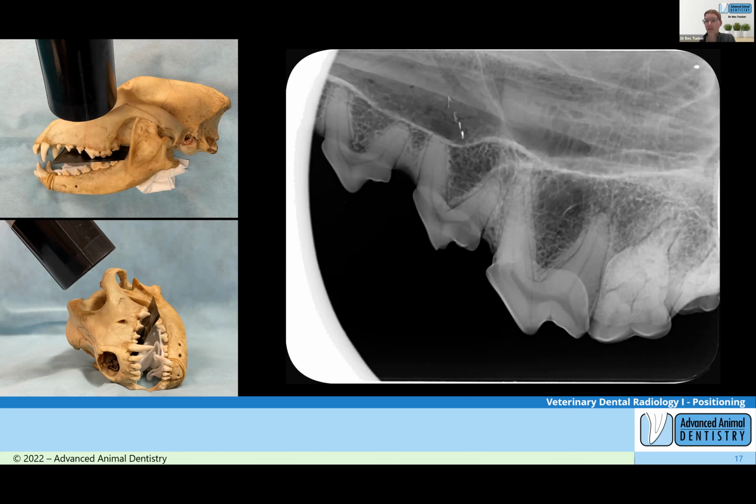If I have an owner or I'm not sure what I'm going to be doing exactly in advance and I need to speak to an owner about something, I'll radiograph one side, roll the patient, radiograph the other side, contact the owner, work on that side, and then roll back, and it's still only moving the patient twice. Yeah, but I agree, and I think the downside to working like that is you have just a little bit more movement. Not a lot necessarily. One more roll back is usually about all you ever need, but it's more movement, and every movement under an anaesthetic is a little risk.